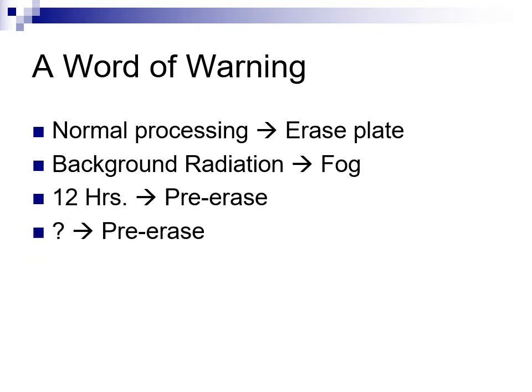If you are unsure a plate has been recently erased, it just takes a few minutes of time to pre-erase it before use. While background fog may not spoil the image to the point of necessitating a retake, fog will diminish image quality, especially contrast resolution.